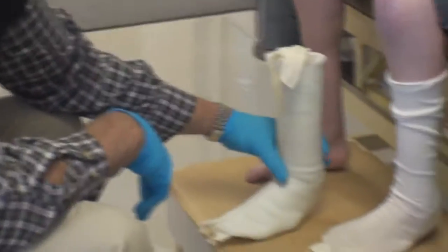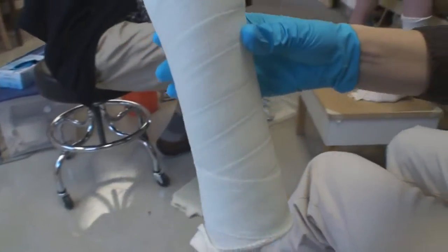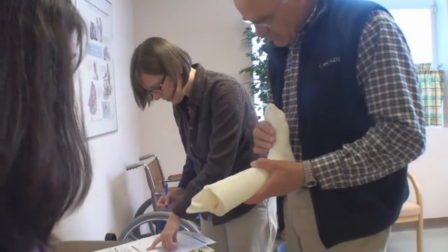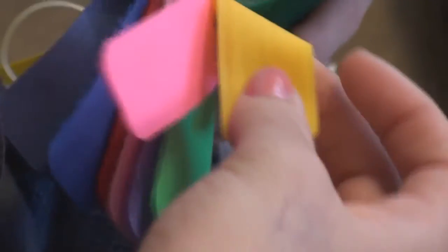That cast is then used to create a mold, which is modified to create more space over areas that need a little more room, a little more support, and areas that can benefit from being supportive. The details for her braces are optimized for comfort: the shoulder, the sewn-in instep pad, the color choices for the padding, the flexibility of the back piece, the height of the trim lines — all of that is specified in the order.